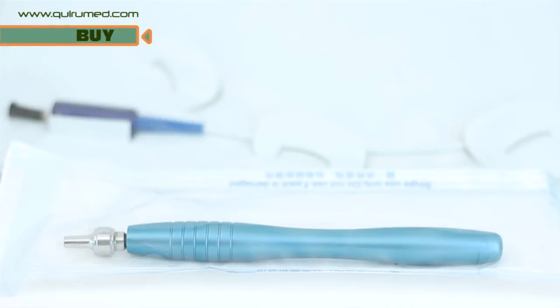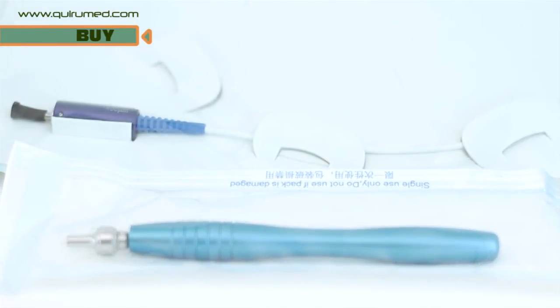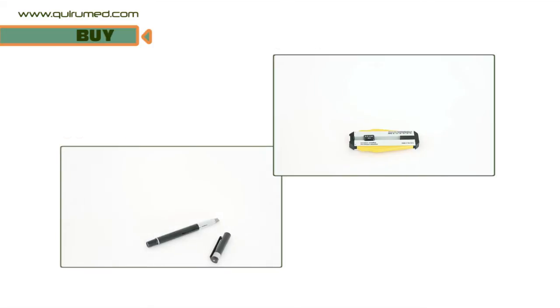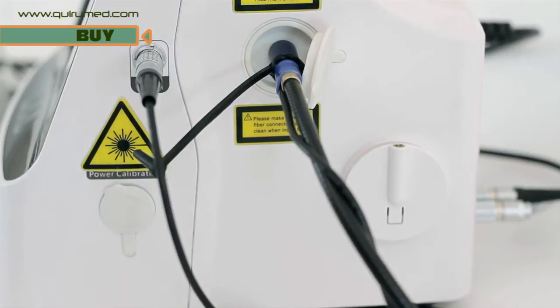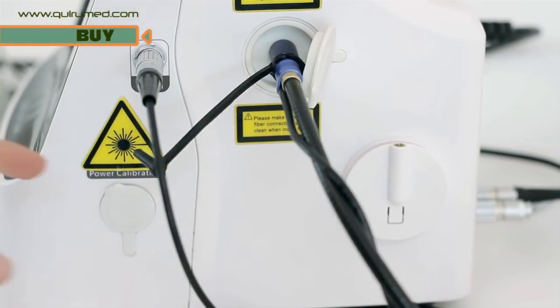For surgical treatment, it is essential that the fibre optic cable functions correctly and is not contaminated. To do this, it will require cutting and scraping when damaged. You may test the power of the laser in the power detection aperture on the right hand side of the G-Box.